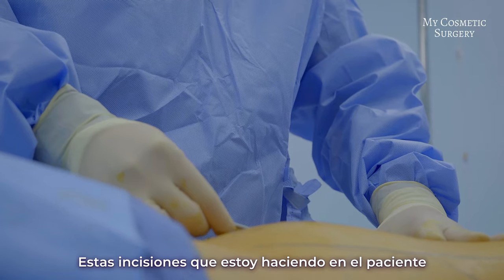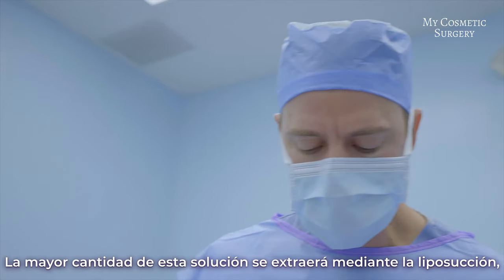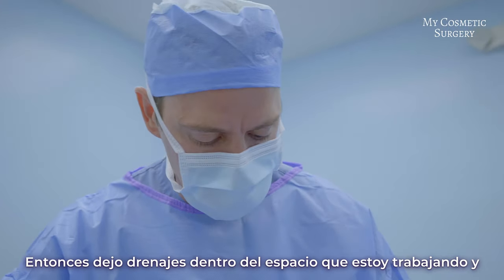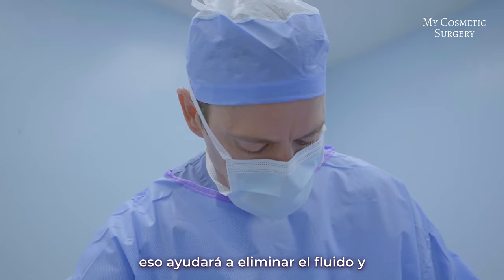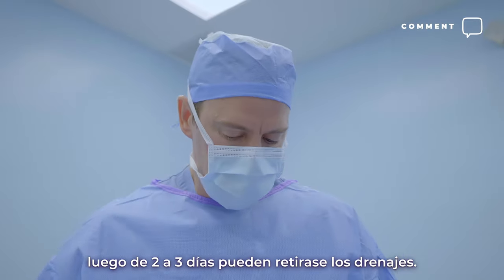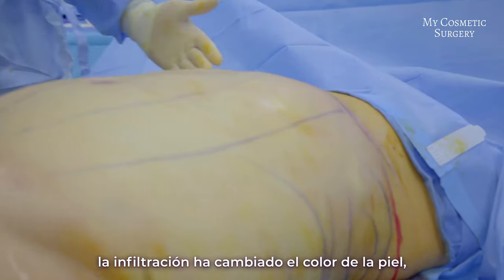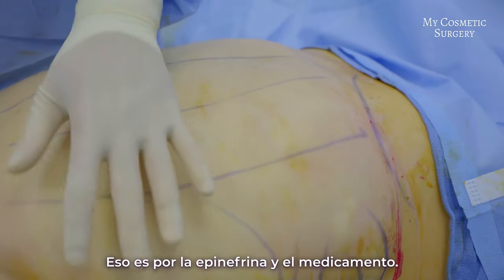These incisions I'm making in the patient are only four millimeters in size — just enough to fit the liposuction cannula. Much of this fluid is going to be liposuctioned out, but some will stay and can cause a fluid collection, so I leave drains inside the space that we're liposuctioning. Those drains will help clear the fluid out over the next few days, and then after two or three days the drains can come out. You can see that the infiltration has made a difference in the color of the skin — it's turning white from the epinephrine.